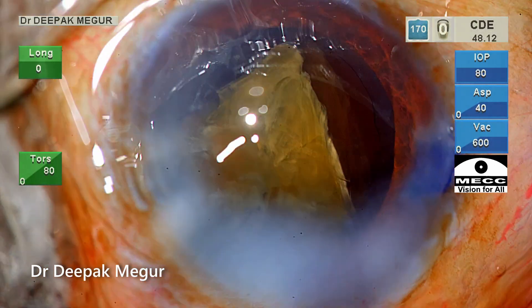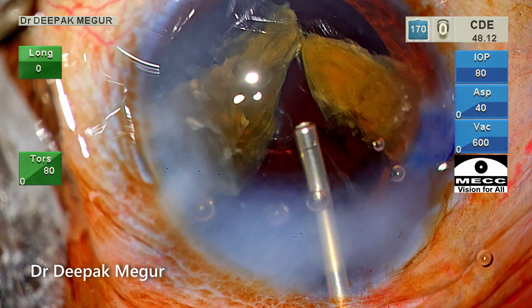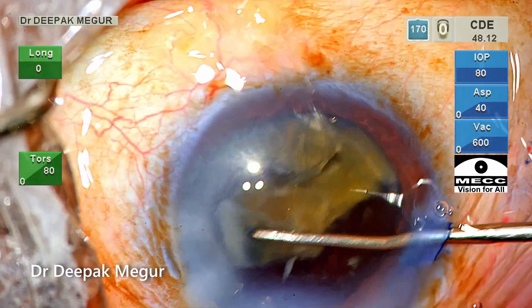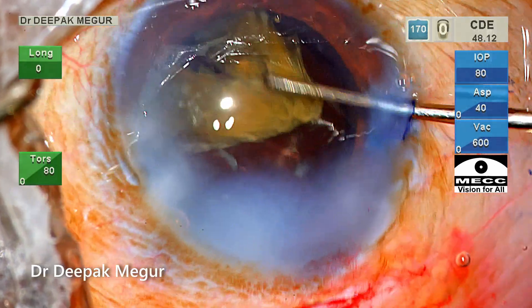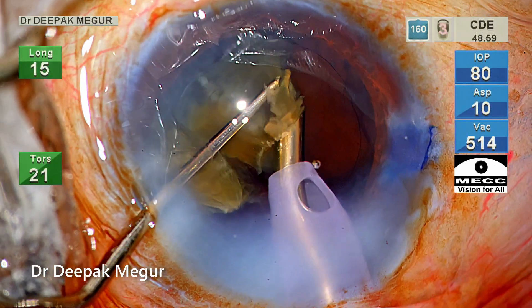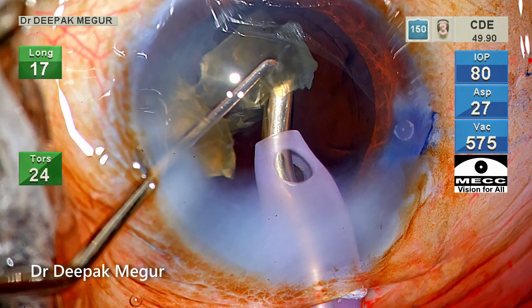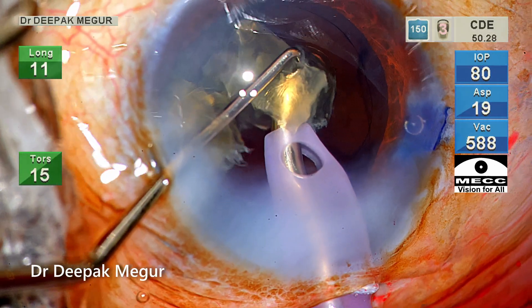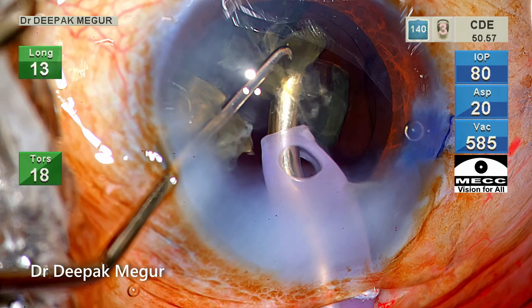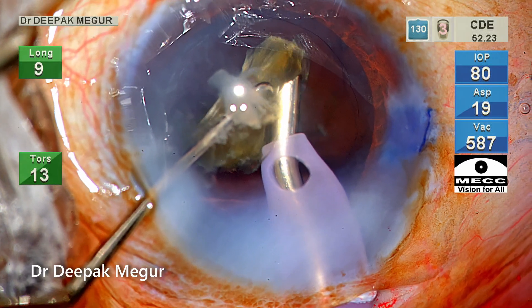Time to deal with the last two pieces as they come out into the anterior chamber. I put OVD in front of them and push both fragments back into the bag, then in a very controlled manner the last two fragments are emulsified. There is a lot of phobia among younger colleagues that hard cataracts are very challenging — I agree, it is challenging — but if you follow basic principles like using the right amount of power to minimize lens chatter, doing emulsification in a more posterior plane, and using lots of OVD, you will be surprised that you can get clear corneas on the first post-op day as well.